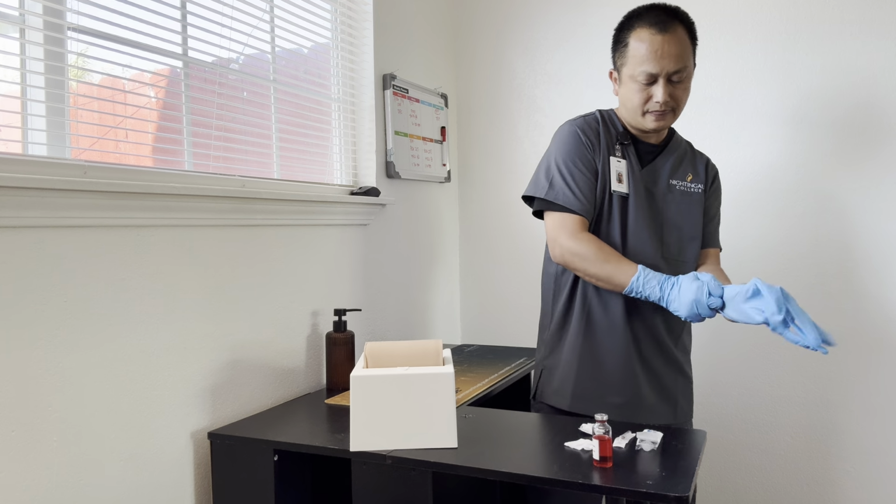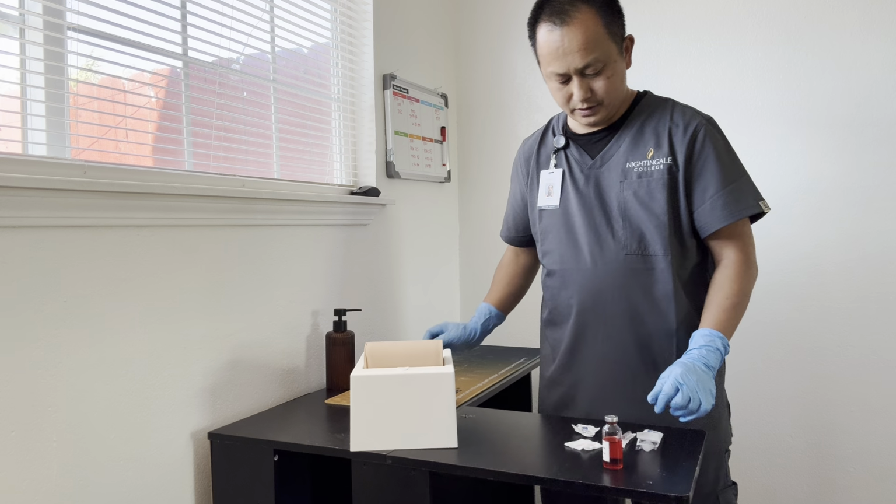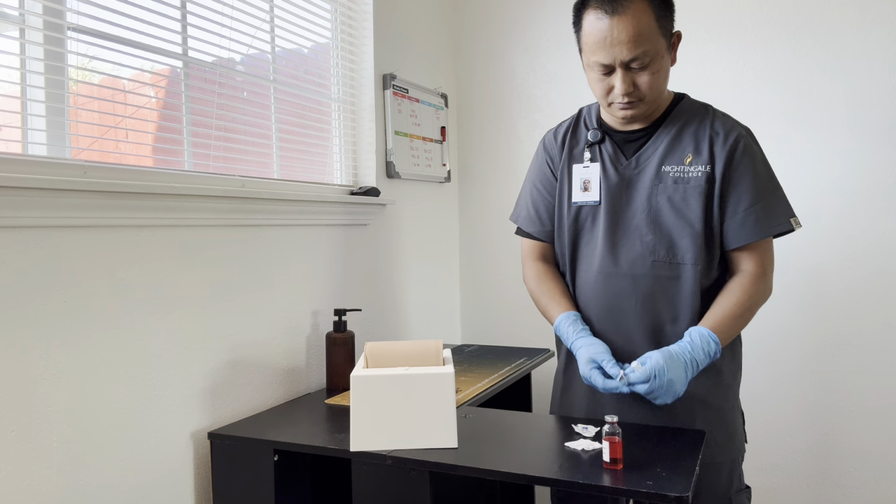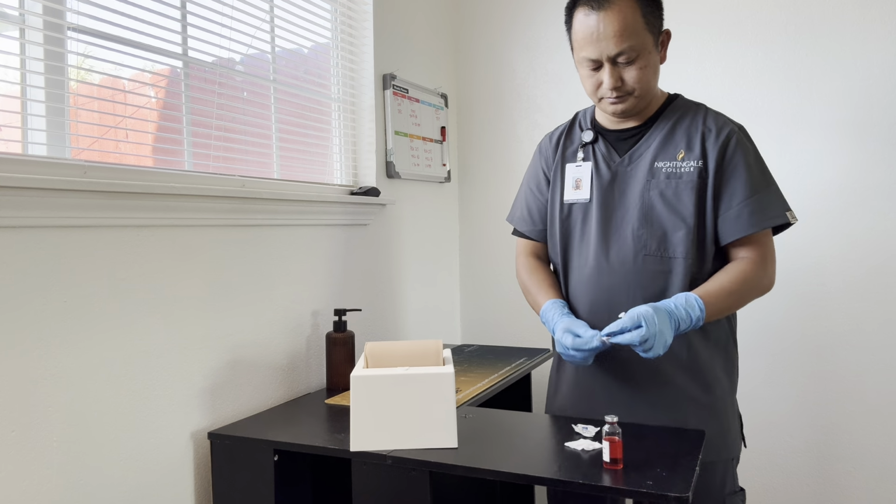We're going to go ahead and clean the lip of our vial here. And then we are going to connect our syringe to our needle. Since I'm drawing out 1.5 ml of the morphine, we have to also inject 1.5 ml of air into the vial.